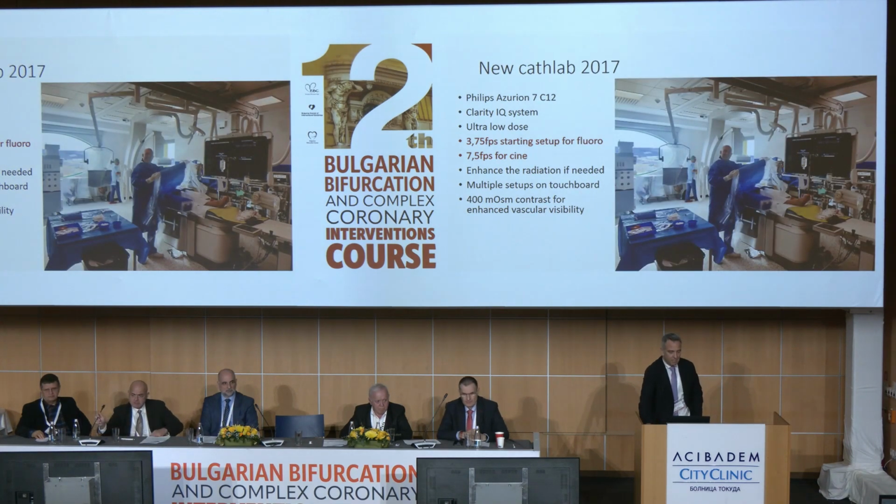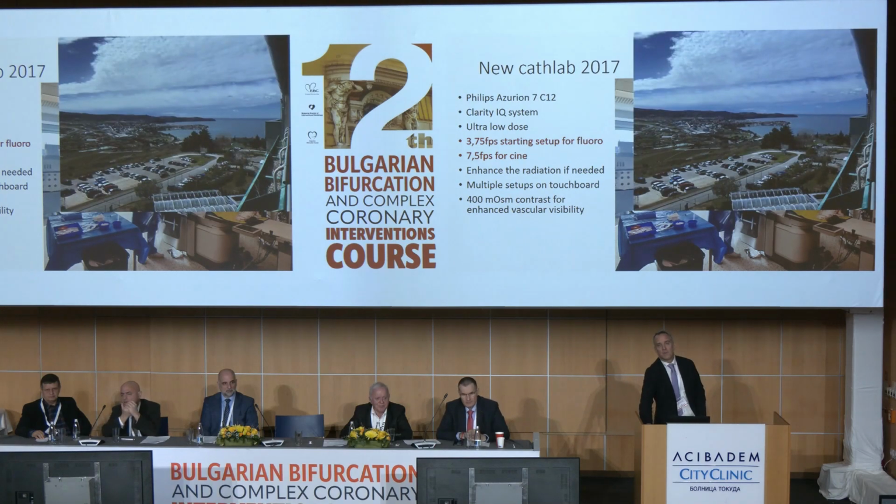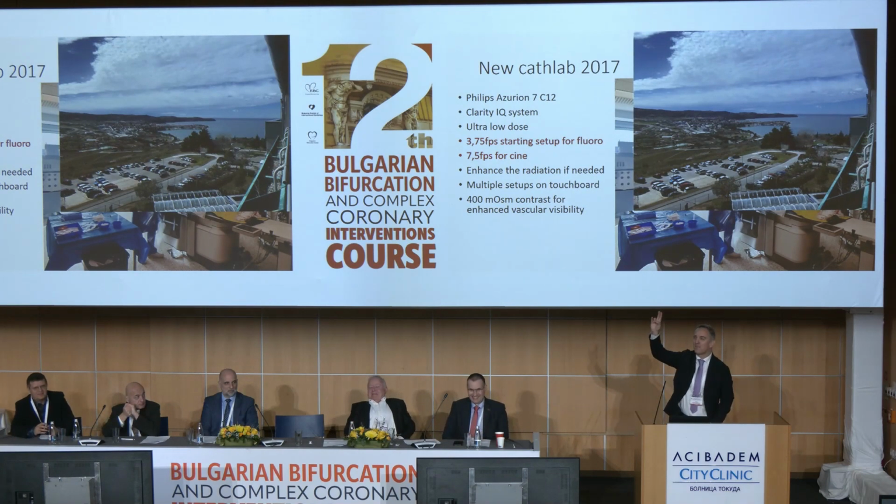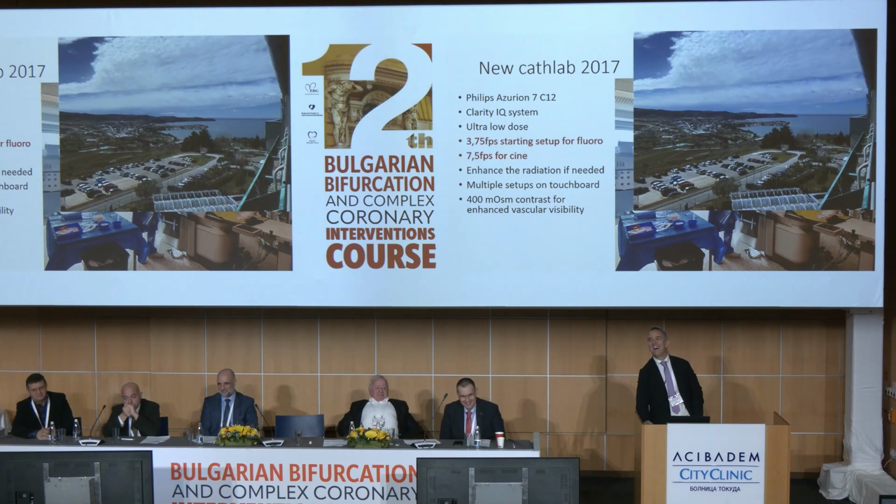So this is my cath lab, and this is the view from my cath lab. So I think that no one in this room has the view like me. If anyone has it, please raise your arm. Yeah, maybe you.